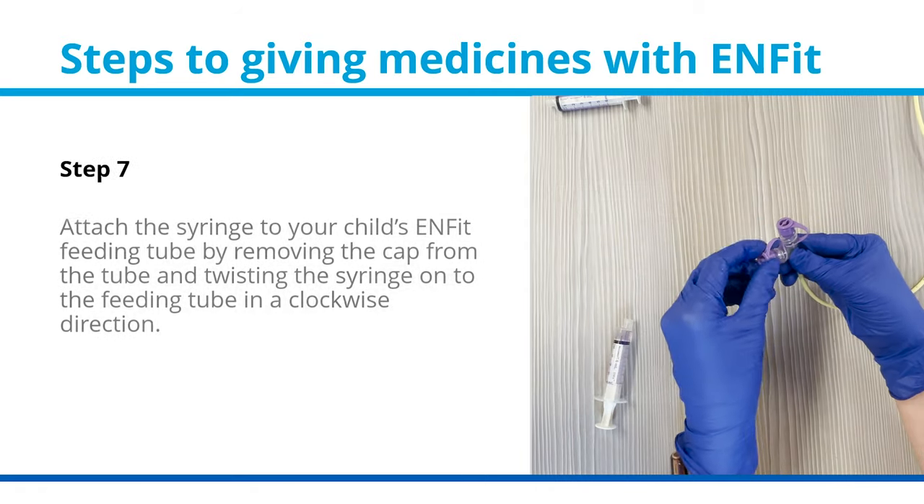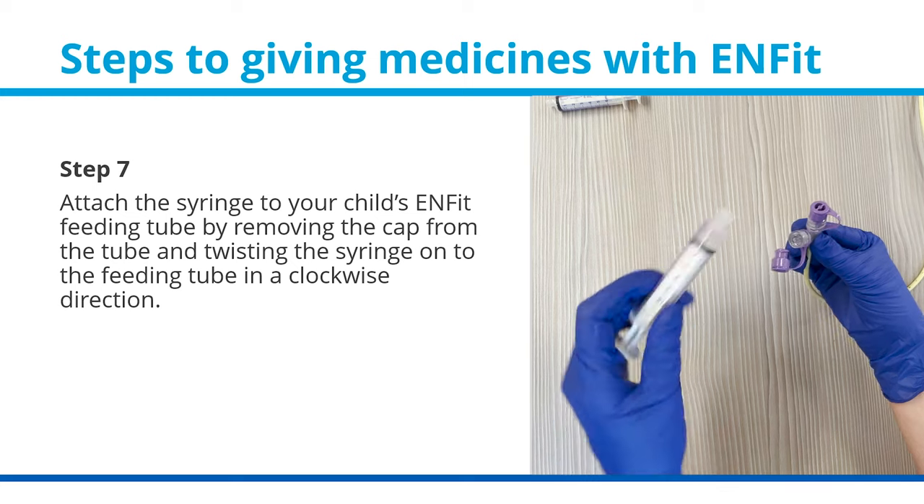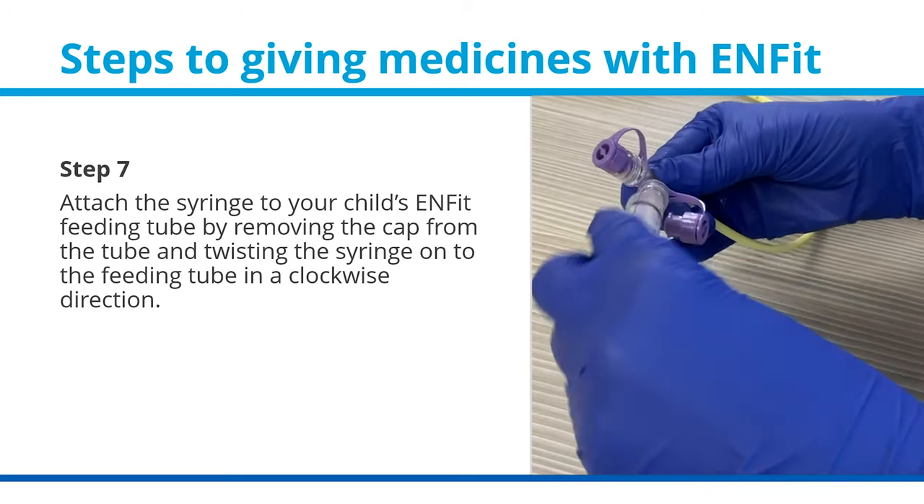Step 7: Attach the syringe to your child's ENFIT feeding tube by removing the cap from the tube and gently twisting the syringe onto the feeding tube in a clockwise direction.